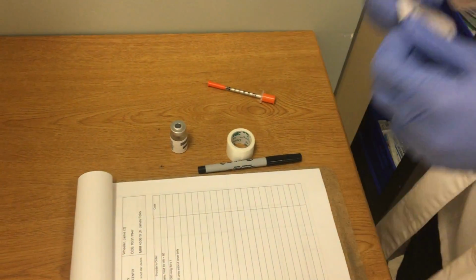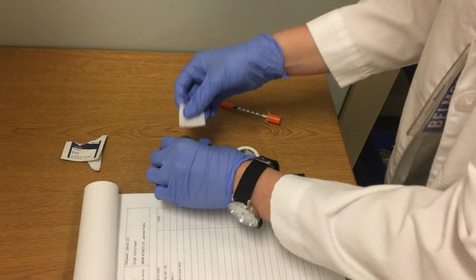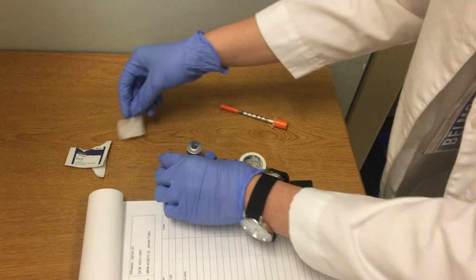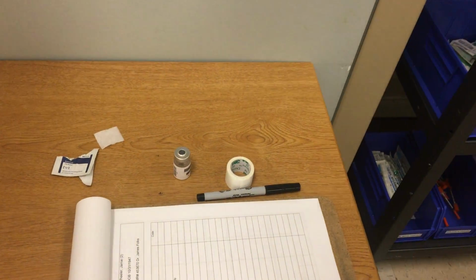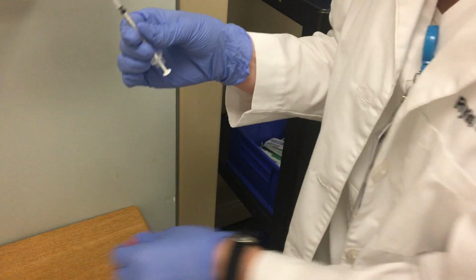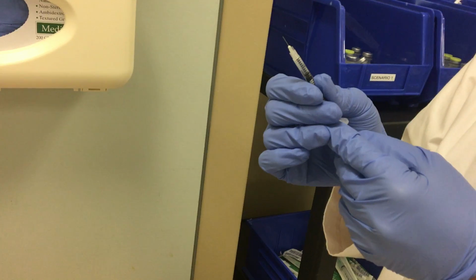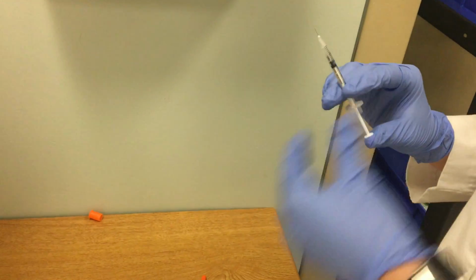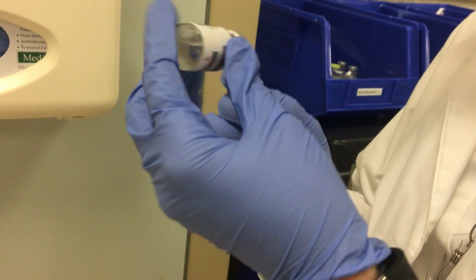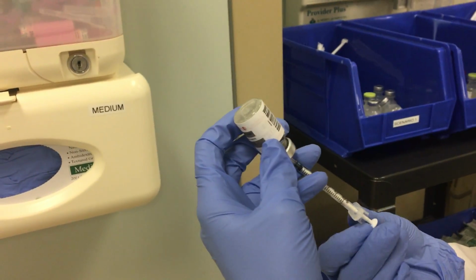I'm going to wipe this off and let it air dry. I'm going to go ahead and get my 10 units.